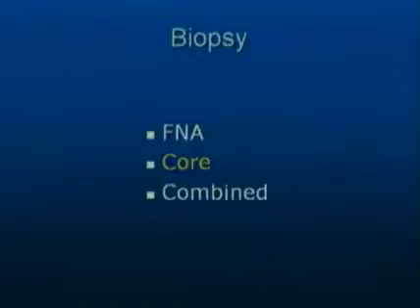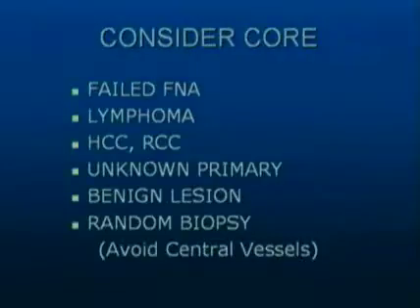Finally, when will I do core? Well, there's a whole host of different reasons. For instance, if somebody's failed with FNA, or I failed with FNA. For lymphomas, it may be very helpful. More so for HCC than RCC.